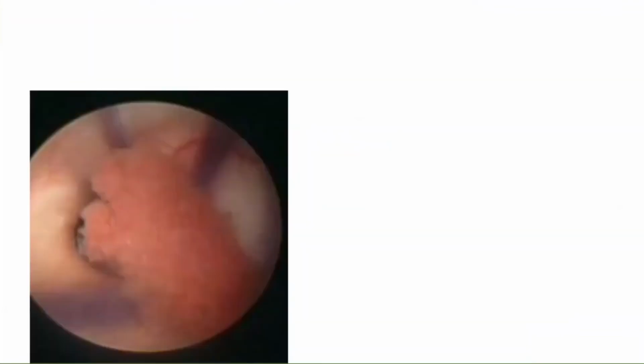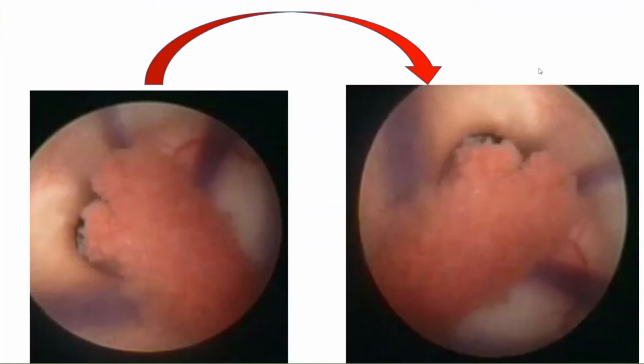So this image was actually this image all along. And if I had shown this image to the residents, then I bet most of you would have had no trouble in identifying the landmarks. Obviously, this is midline, right? Because this image now matches what you expect to see for the right foramen. You would expect to have the midline here, lateral, anterior, posterior.